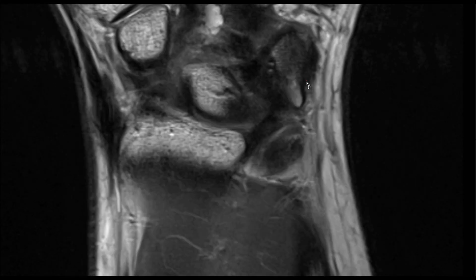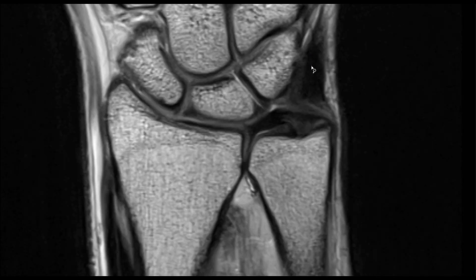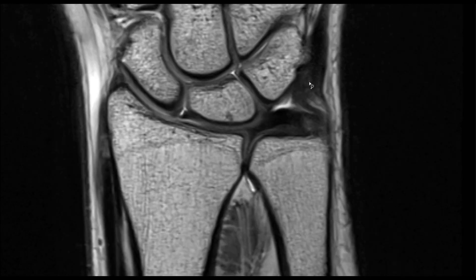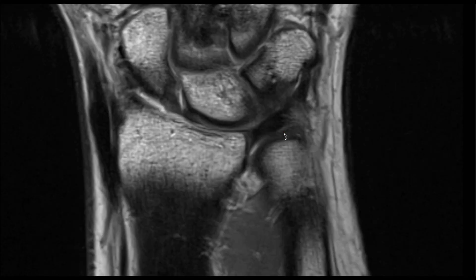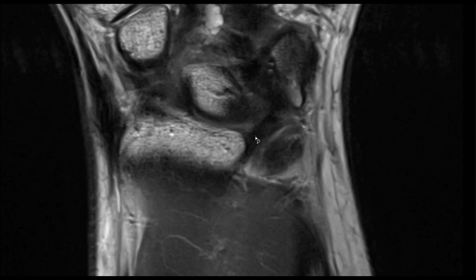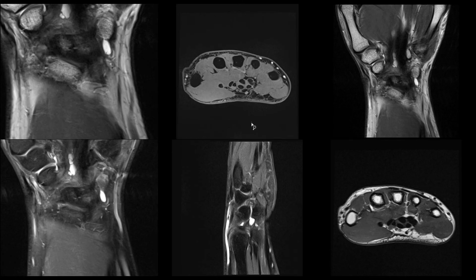Typically the ulnar collateral ligament and the ECU tendon are not well depicted and not so important on these views. To find the ulnocarpal ligament, you scroll on your coronals volarly and can see this bent V-shaped structure: this one is the ulno-triquetral ligament, and this one is the ulno-lunate ligament. They are better depicted on your sagittals.